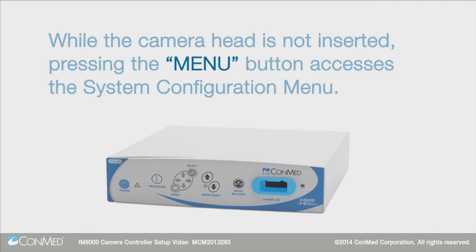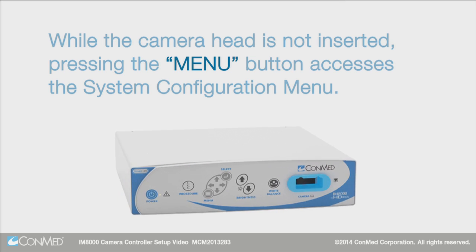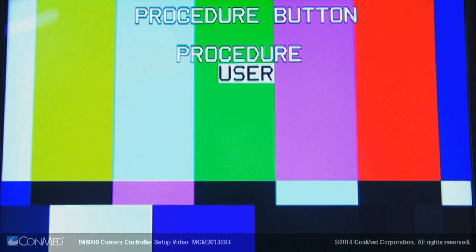While the camera head is not inserted, pressing the menu button accesses the system configuration menu. This menu displays five options. Press the select button to enter the procedure button menu, which allows you to change between the optimized procedure presets installed on the camera or user-defined presets.